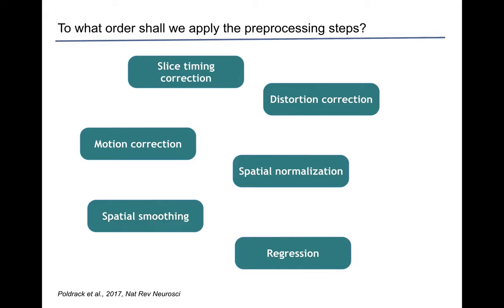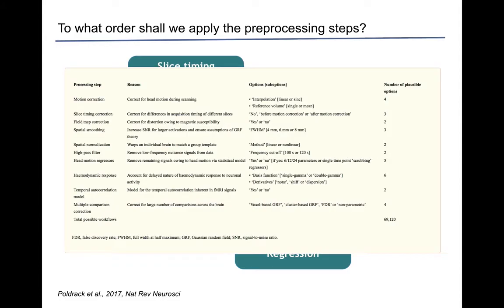There was a paper which looked at the possible ways of processing the data, and I believe the possible ways were only using FSL.